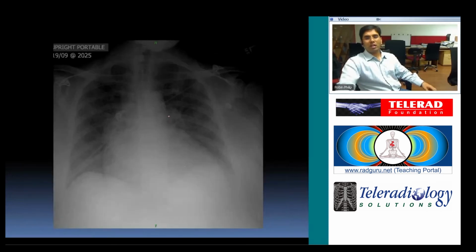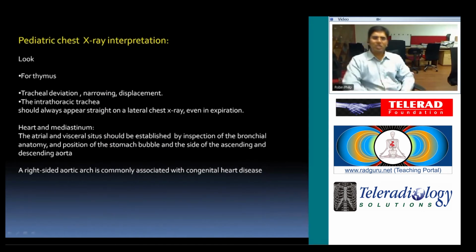And another patient, you can see the heart enlarged, and then you can see an additional shadow here. That's the left atrial enlargement, right? And you can see the prominent markings here. So the patient is in failure, so probably left heart failure. And then coming to this pediatric chest X-ray, chest radiographic interpretation.